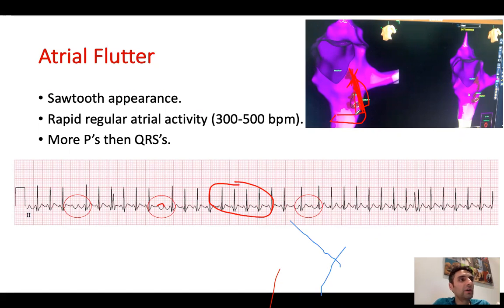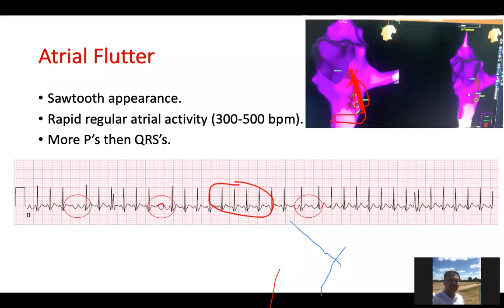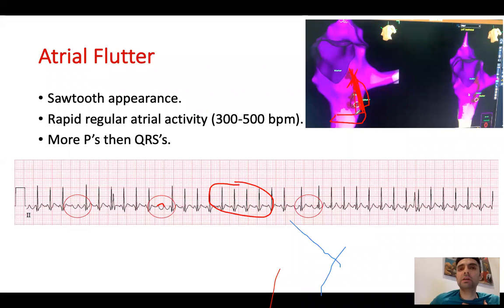So you cardiovert. Where do you place the pads? You said it before. One pad will be posterior. Yes, one anterior, one posterior. Because the atria are, yani, posterior. The left atrium is posterior, they are posterior structures. So you want to hug the atria.